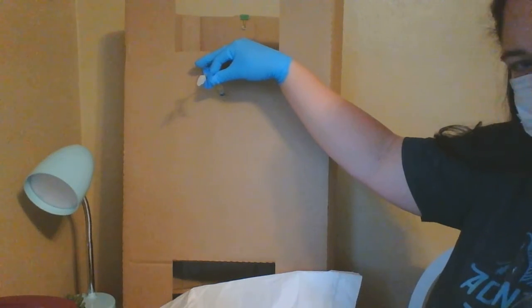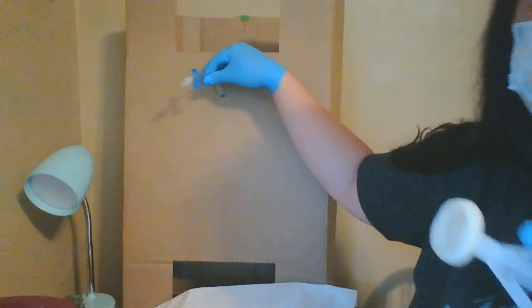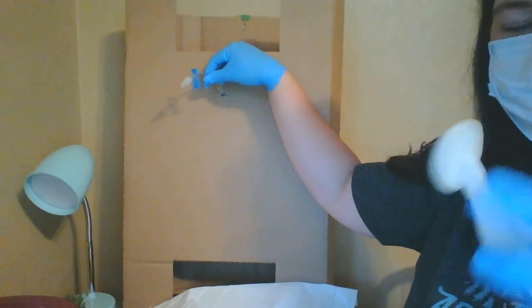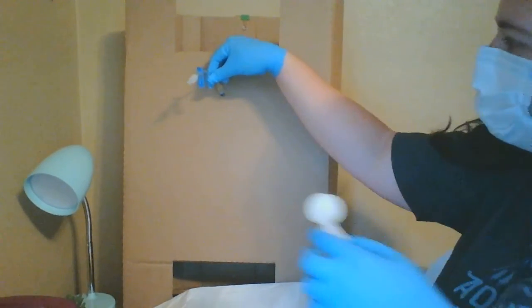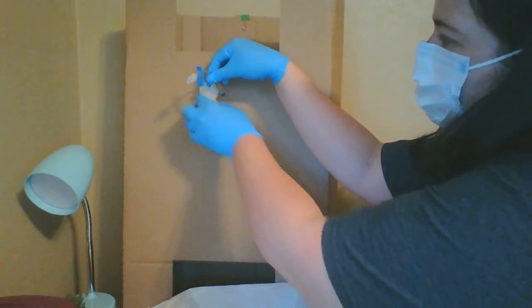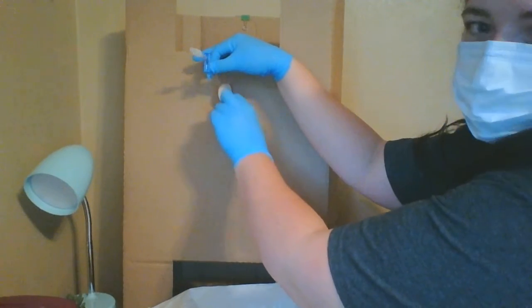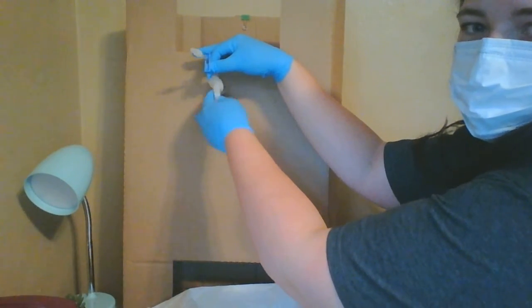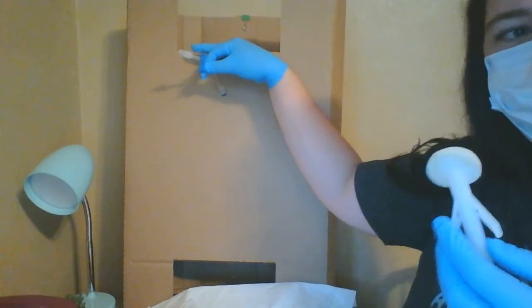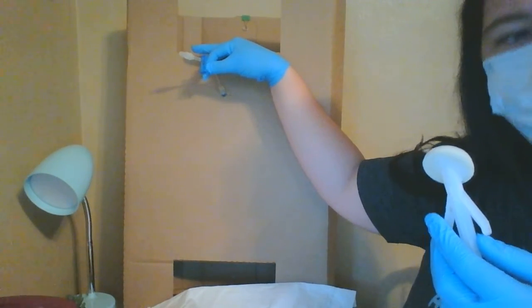So first I'm going to do the chlorhexidine swab. Now I would just push these two levers in and it would come out in the foam part. And then you clean the dirty. So I would do around the base first, and then clean up on the tube a little bit. Now I would throw this in the vial.